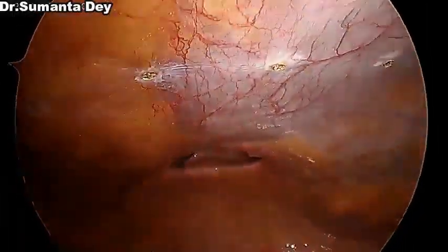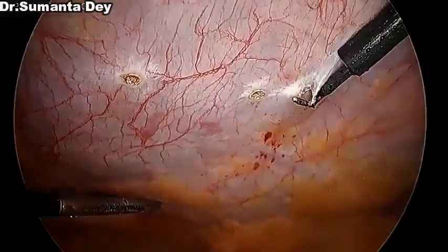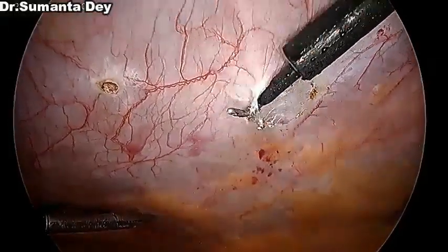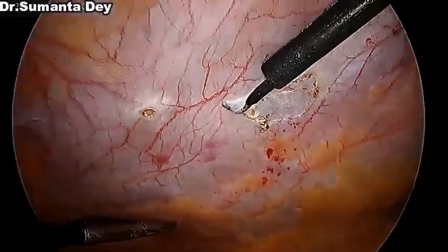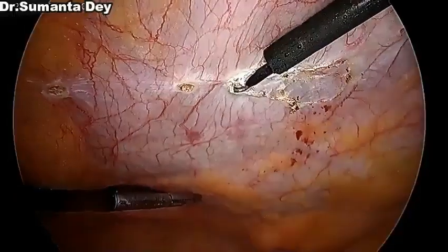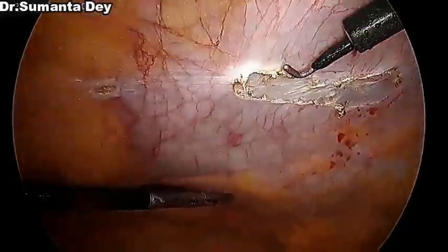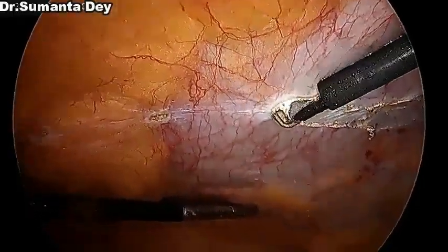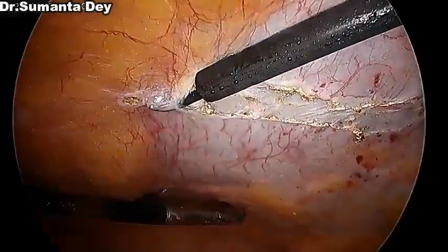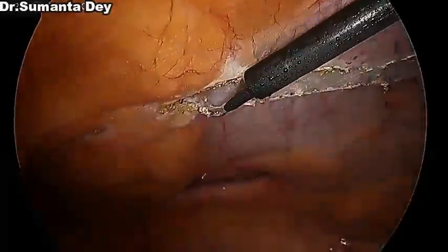So it's around 5 cm proximal to the upper border of the defect. And now gradually, I'm lifting the peritoneum. You can see I'm using monopolar cautery gently. First, with the tip of the instrument, I'm just creating some space between the peritoneum and the posterior rectus sheath, and then a little bit of energy application to divide the peritoneum. While doing this, you should take care that you do not injure the posterior rectus sheath and get into the retrorectus space. It was just the peritoneum.